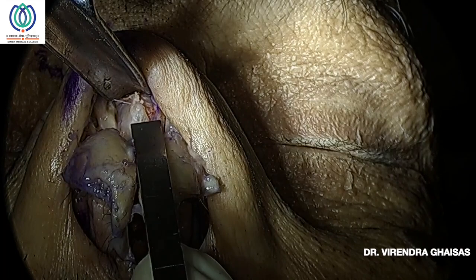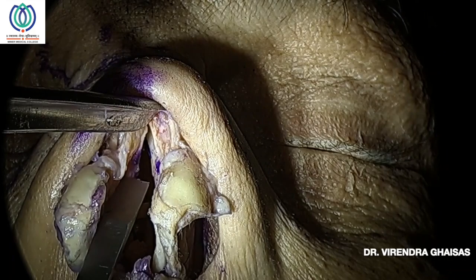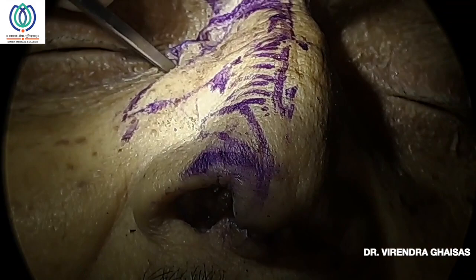Take the 3 mm osteotome, and with the sharp edge you cut the periosteum so that the bleeding is less, the angular vein drops in, and the injury to the angular vein is less. You start a low to low osteotomy, which is continuous, not like a stamp one, till the level of the medial canthus, and then complete these fractures with a transverse osteotomy.